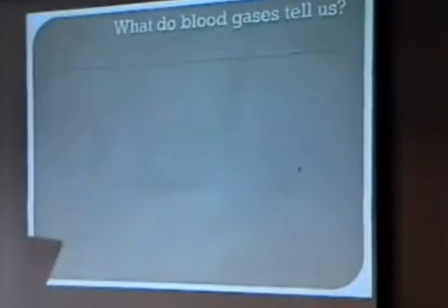These three things are measured. The blood gas machine will measure them, so they're very accurate, depending on the accuracy of your blood gas machine. But generally, bicarb, base deficit, and oxygen saturation are calculated numbers. And we'll see how the calculation can be different from the truth. If they can calculate it, so can you. And that's why we need your phone.